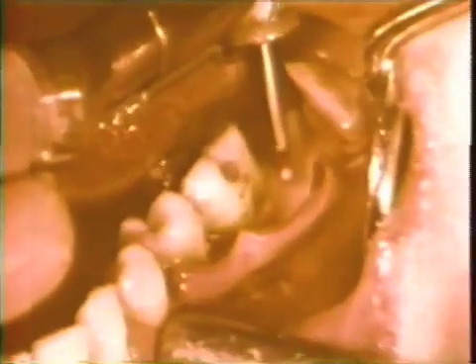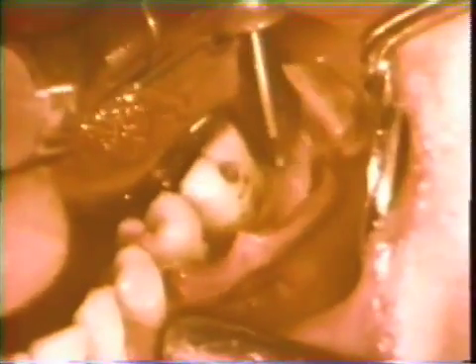Contouring of the alveolar process permits a rise to develop in the osseous tissue distal to the molar. The rise in this septum tends to simulate what is referred to as physiologic osseous architecture. The buccal plate in the area of the furcation is also contoured. The crest of bone is blended around the buccal aspect to assure the establishment of physiologic osseous architecture.